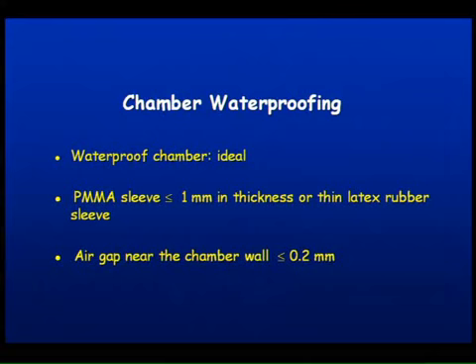So all measurements are to be made in a water phantom, so the chamber must be waterproof. The ideal condition is if the chamber is waterproof, and if it is not, you can use a PMMA sleeve, thickness less than a millimeter, and such that the air gap near the chamber wall and the PMMA sleeve is less than 0.2 of a millimeter.